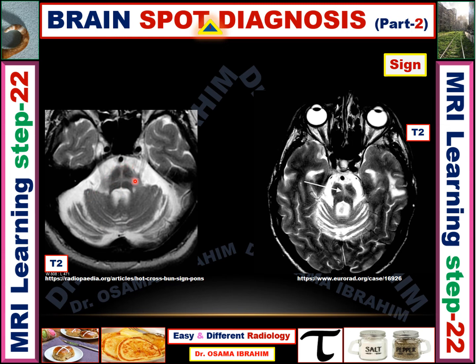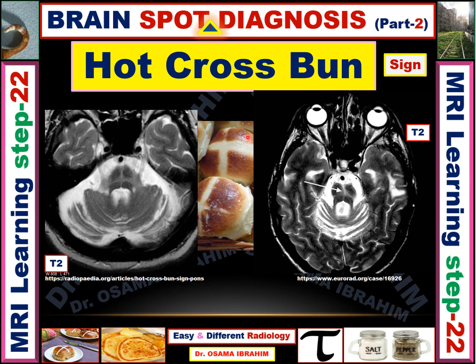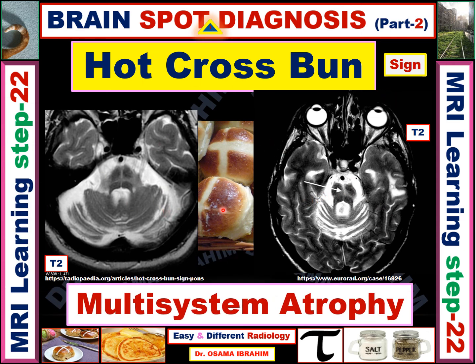The pons shows abnormal high signal on T2, which looks like a specific pattern. This is called the hot cross bun sign. This is another patient showing the same sign — abnormal high signal within the pons of the posterior fossa, with the fourth ventricle visible and the cerebellum appearing atrophied. The hot cross bun sign represents multi-system atrophy as the diagnosis.